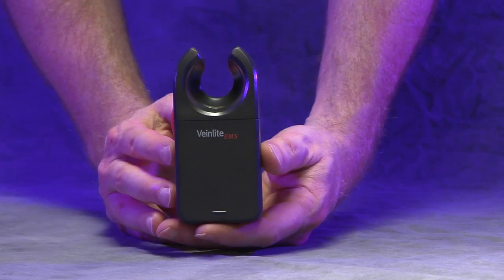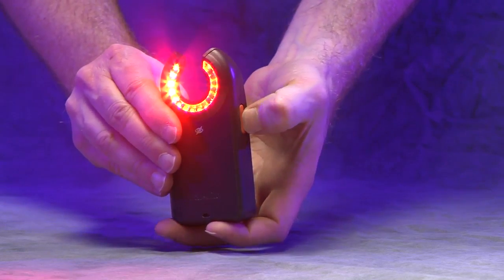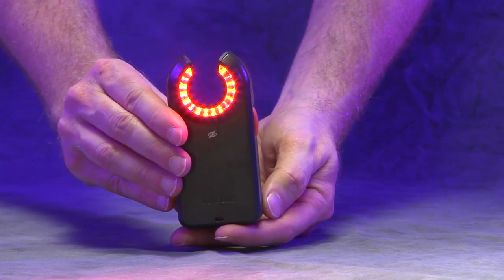If only one button is available on your device, it will activate the orange and red LEDs at the same time. While this simplified setting is designed to work with all skin pigmentation types, it will not provide the same contrast options of a two-button device.